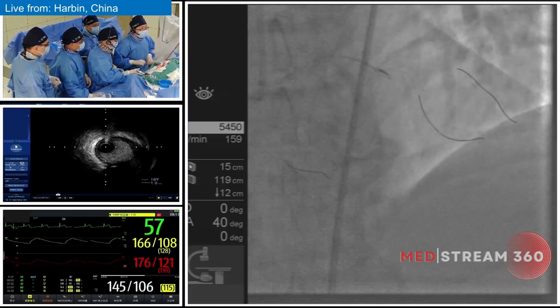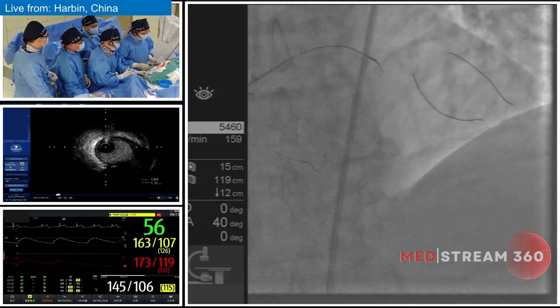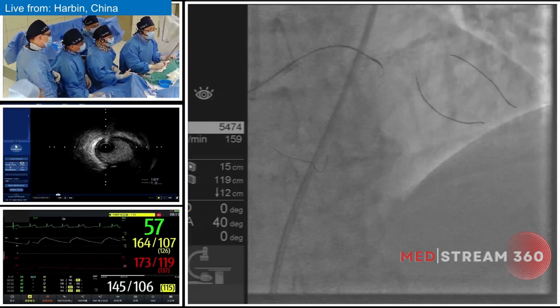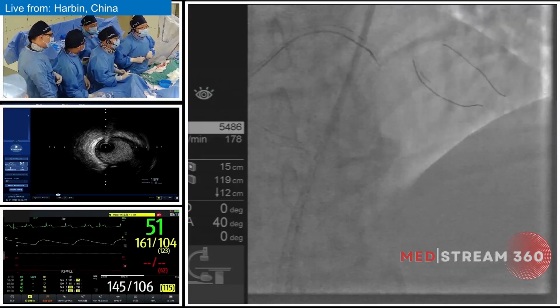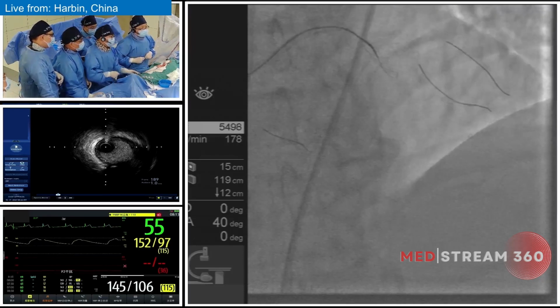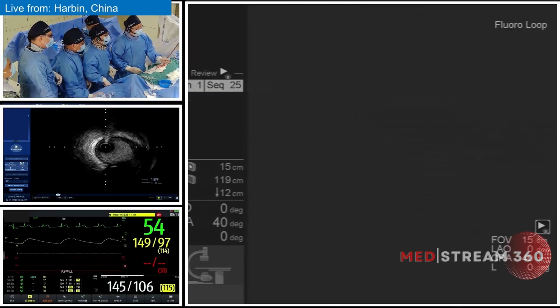And actually, I think that this is a very dramatic CTO case with a blunt tip of the proximal occluded LAD. There are several things that we need to discuss in full detail. First thing is that I think this one is a J-CTO score 3 case. First, the occluded segment is over 20 millimeters from the CTO reconstruction and also from the lateral angiography at that time.